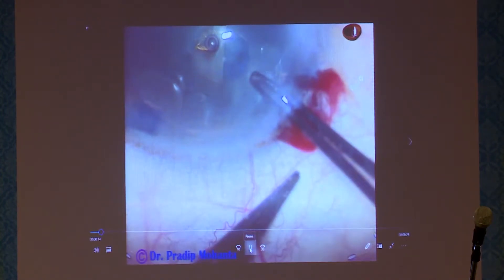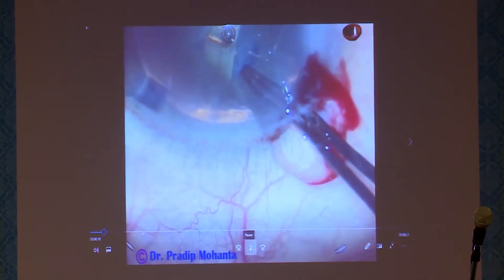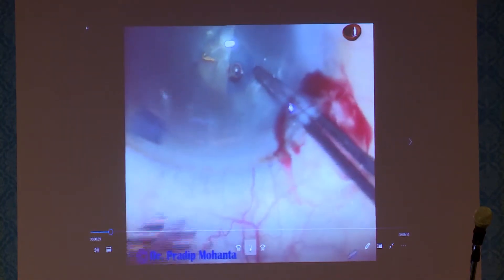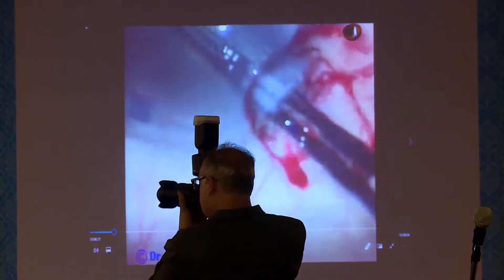Don't depress the posterior leaf. If you depress the posterior leaf, the viscoelastic substance will come out. When you are learning, if it comes out, just inject some more viscoelastic substance. Train your subconscious mind to keep the anterior leaf lifted up. If you do this, you will learn use of utrata very well.